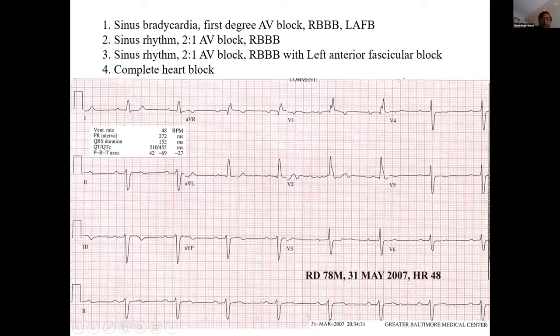I don't know, Rafique, by the clinical context, if the patient comes in with dizziness, syncope, one important message, this is most likely infra-Hisian block. You cannot leave this patient in the evening for a pacemaker tomorrow, because this may be a catastrophe. So yes, we actually had a patient like this. Rafique, you are absolutely right, the patient came in with this kind of rhythm, and on day 3 developed sudden VF because it was persistently bradycardic, and then the patient probably received some antibiotic and developed an arrest.